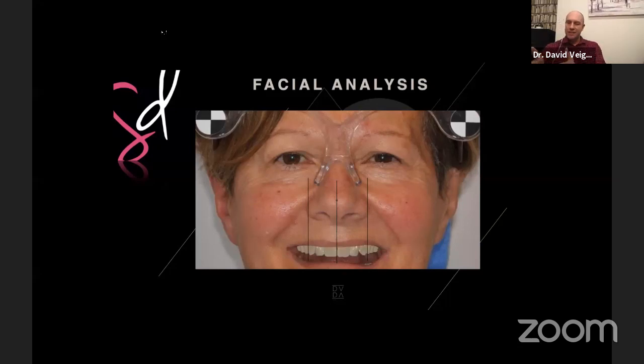And all this is a staged procedure with the patient where I'm walking them through a restoration that is going to grow on them a little bit, because they're allowing me to let them grow with it. If I just said, okay, that tooth position looks right, I'm happy with that, they've never seen it before. Once I deliver that restoration, sometimes they can be taken back from it a little bit. So I like this gradual stage thing. Now, the flip side is that if you show them this, you better be able to deliver this.